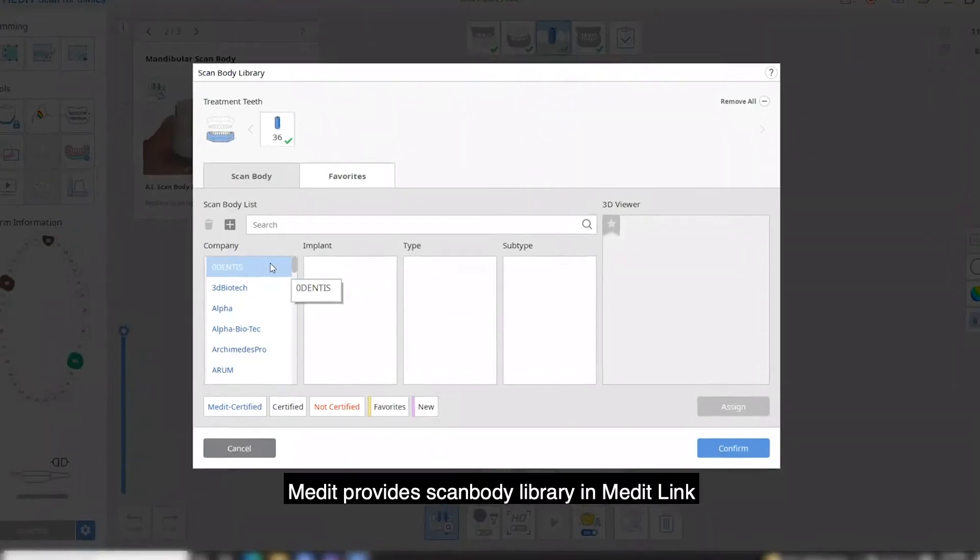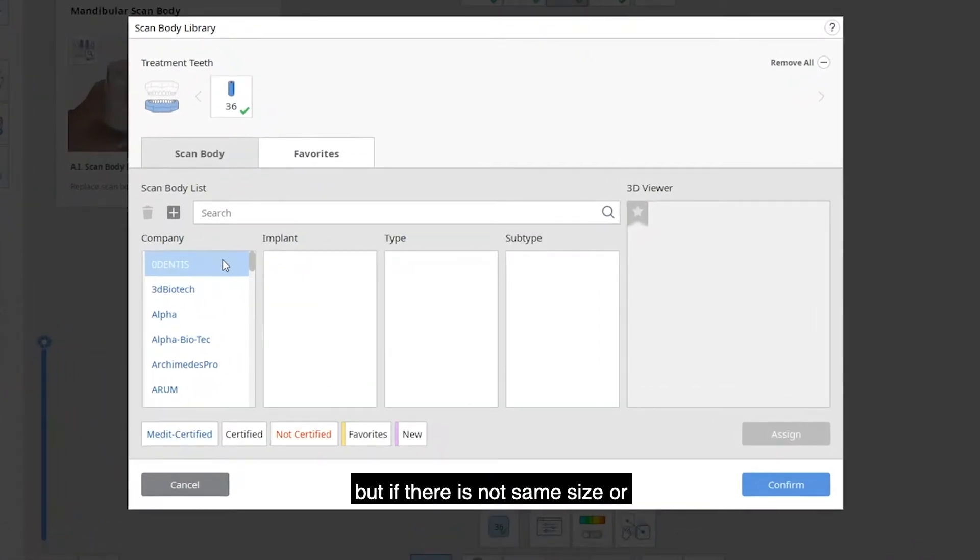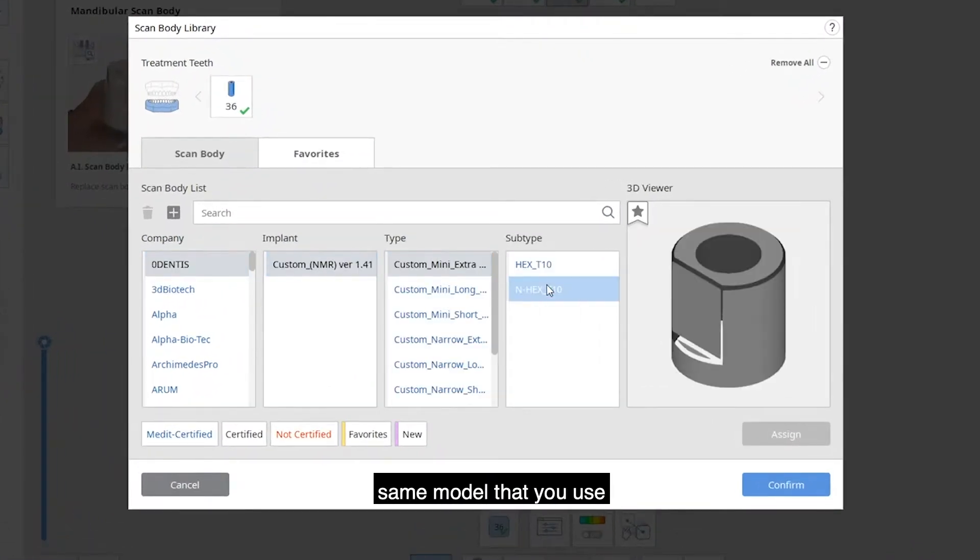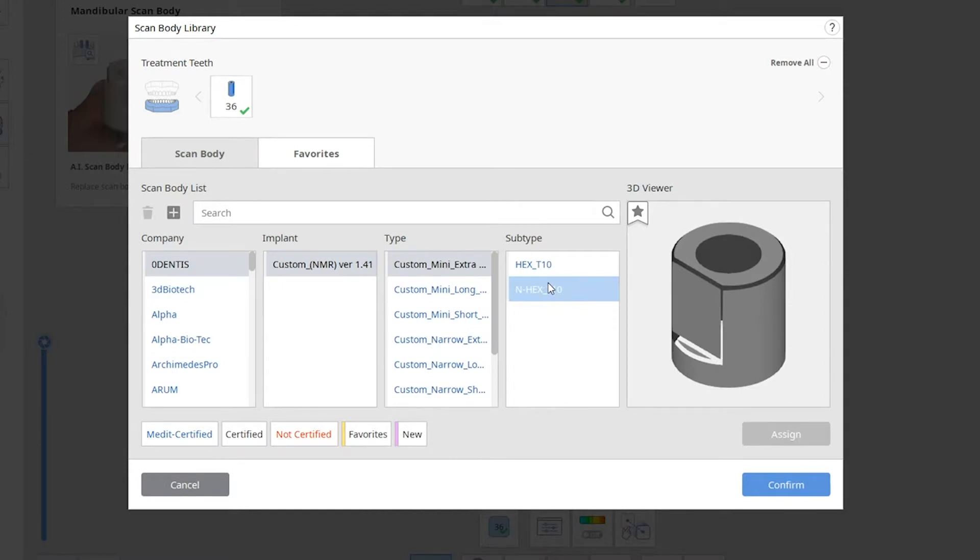Medit provides ScanBody library in MeditLink, but if they don't have the same size or model that you use, you can add your own ScanBody library as well.